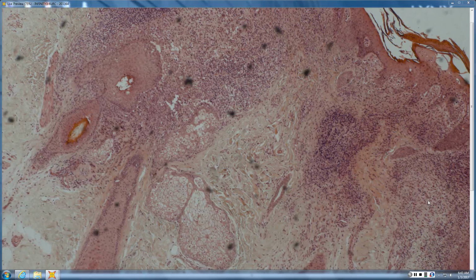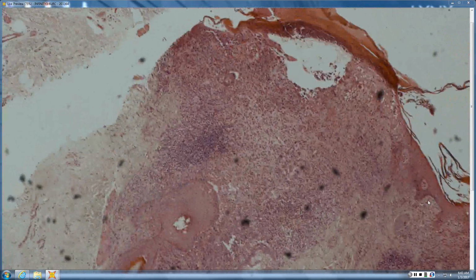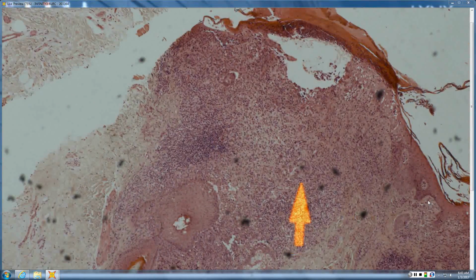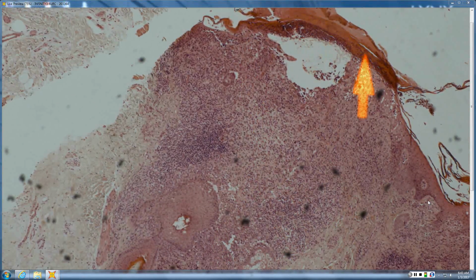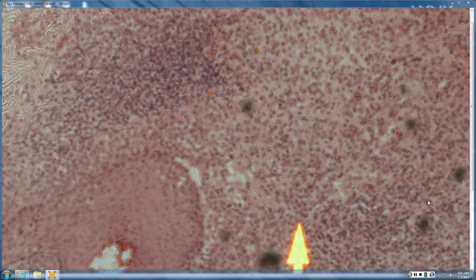So it doesn't quite look like acute lichen planopilaris or anything else with a bunch of inflammatory cells around the infundibulum. Getting closer in, you start to make out that these are larger cells, and it's just not right. There is this crust and maybe some neutrophils over top of it, and you can often get that crust with Langerhans cell histiocytosis.